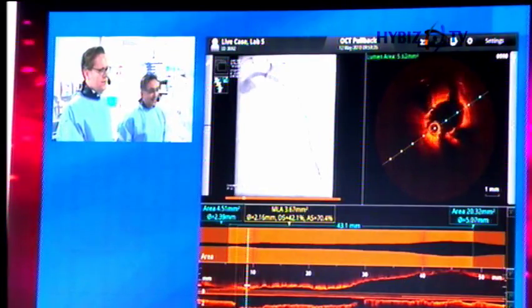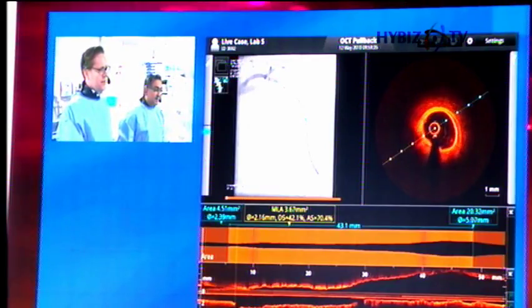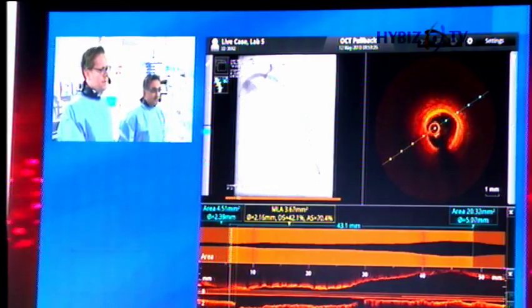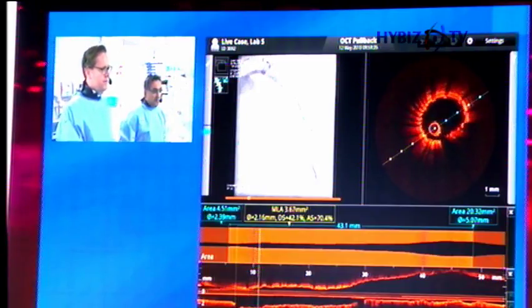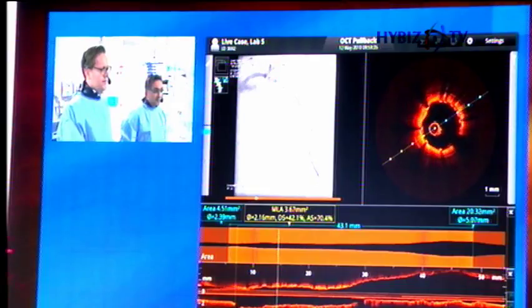Anyway, why don't you just play the whole thing through? Let's see it raw, distal to proximal. So we're now just going to do the pullback, and you can see on the co-registration the little white dot that shows where we are. We've got the high res, it's quite slow, there's a lot of data there. So our distal stent is beautifully apposed there, and there's no dissection. And you can see it's really quite a small vessel distally.